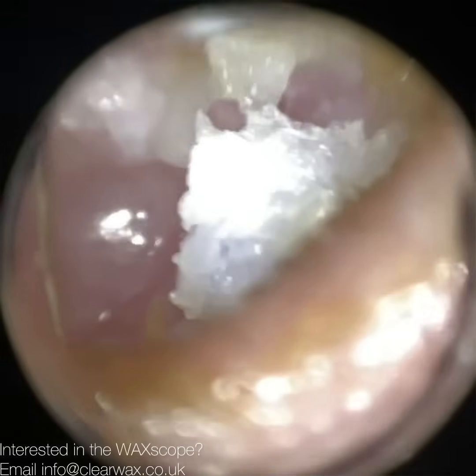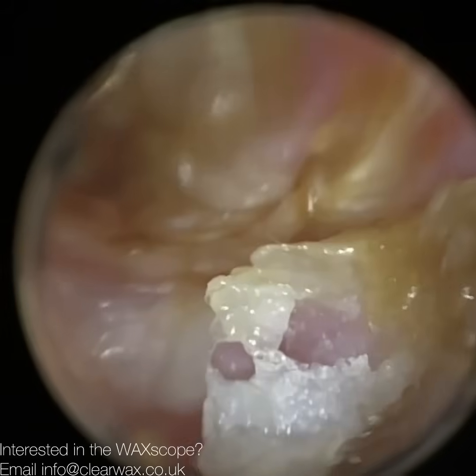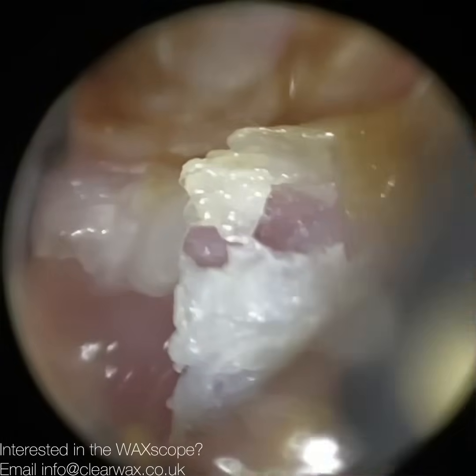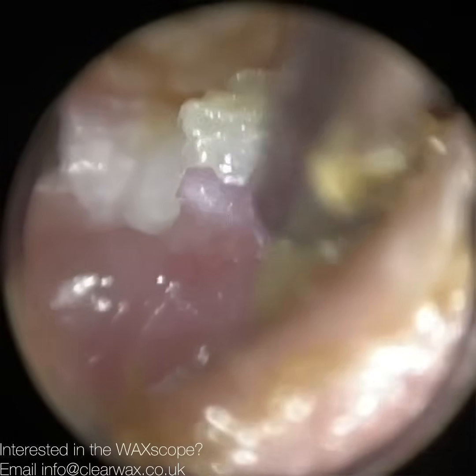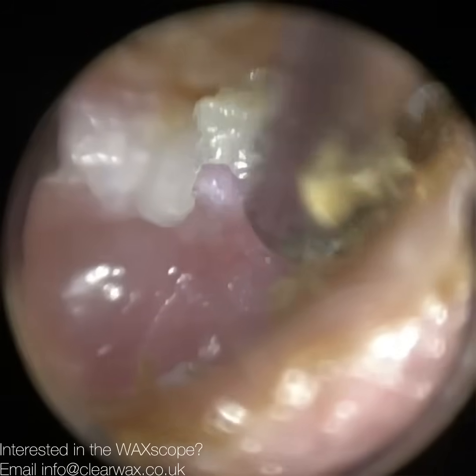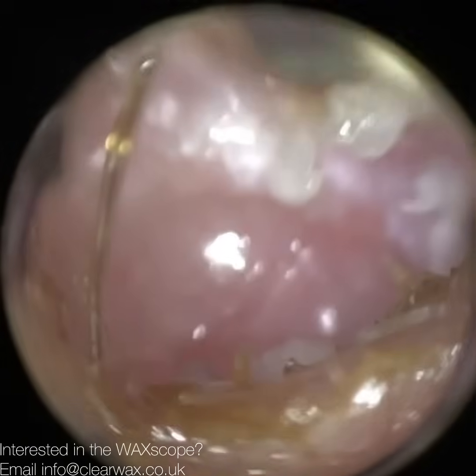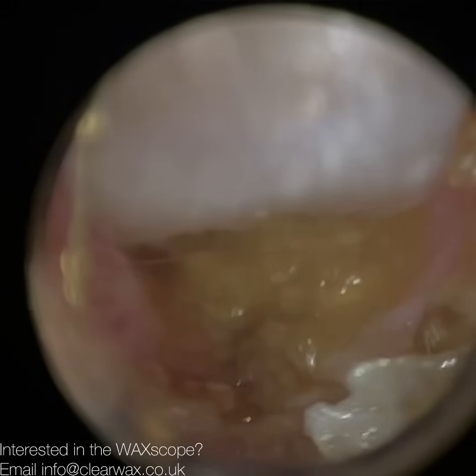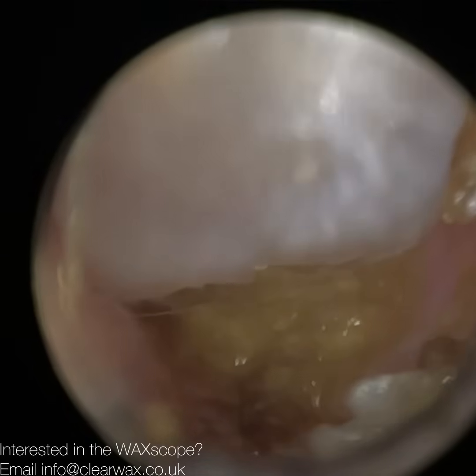So in this particular case, the skin is still intact. You'll see it once I can remove it all. So there's no ulceration, there's no sequestrum of the bone, there's no loose bone. There's no fragments of bone for me to remove. In the case of a benign osteonecrosis, they typically occur at the floor of the ear canal. So I suspect that region of the ear canal is more susceptible because it's already got reduced vascular supply compared to other parts of the ear canal.